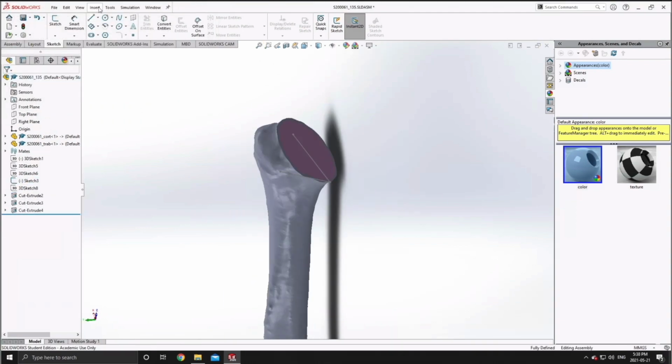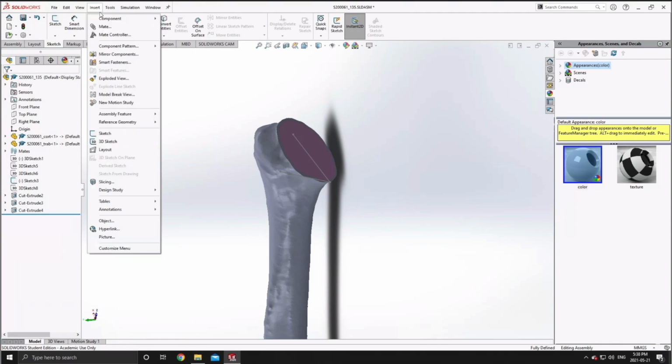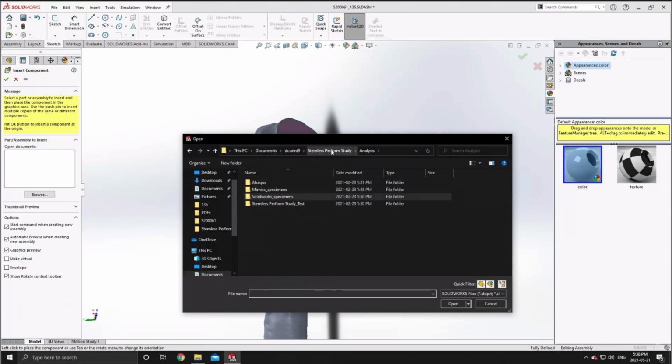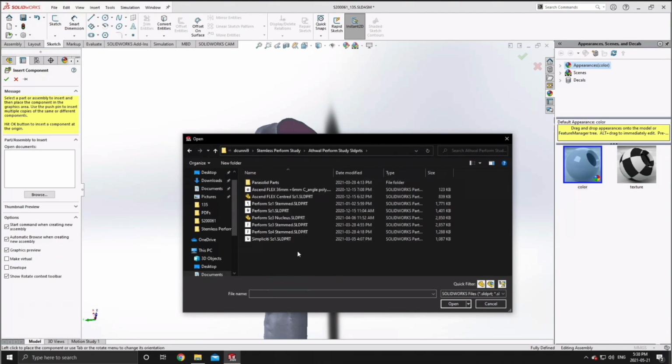Now it's interesting, even sped up to 20 times the original pace, this is still quite an extensive procedure in order to get implant positioning correct.